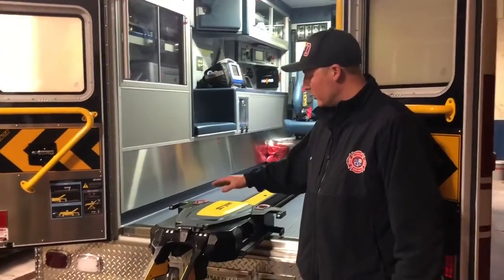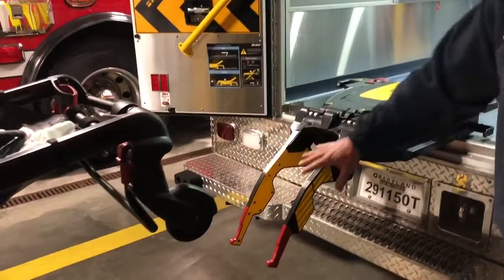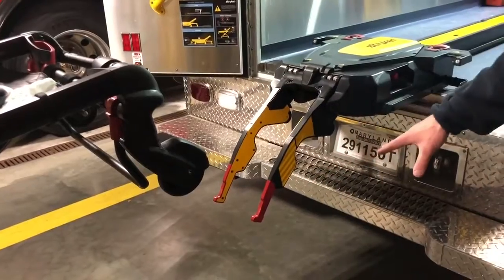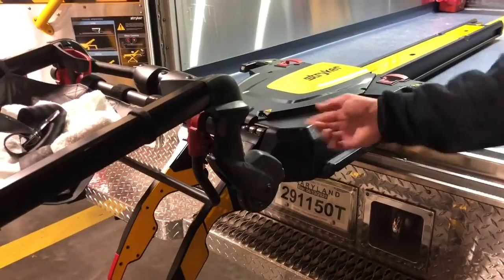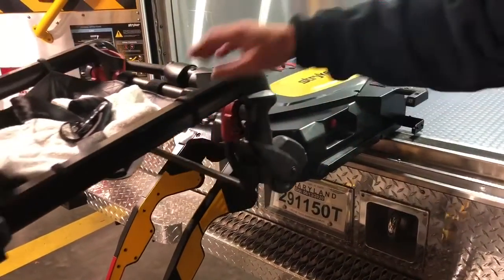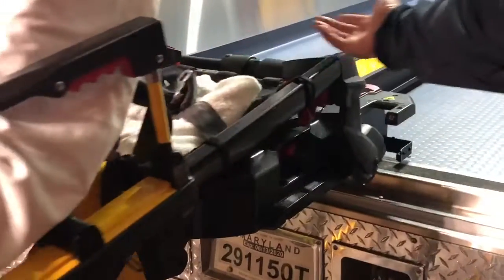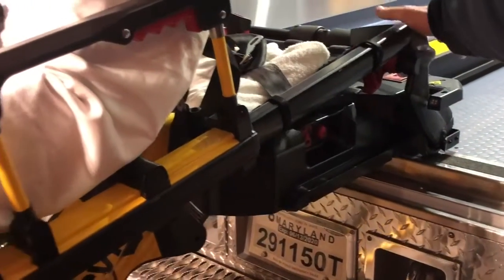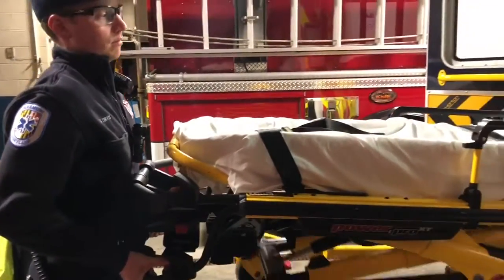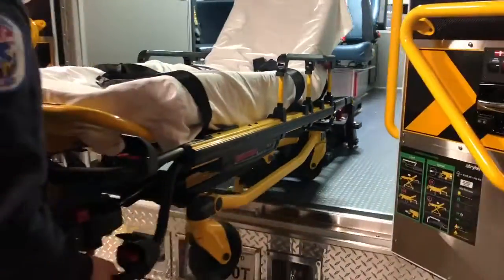Now we're going to review placing the stretcher back into the ambulance without the power load working. The arms are going to be down — they dropped from you pushing the manual button and they drop all the way down. You'll load the stretcher back just as you normally do. The only thing you won't see are the flashing orange lights. You'll notice you don't have the green lights because the system is not on. You will manually pick the stretcher up and raise the legs, then push the stretcher back in as you normally would in one of the older ambulances.